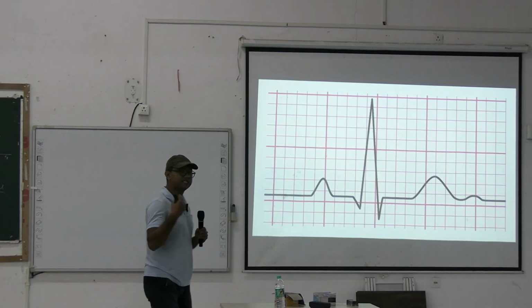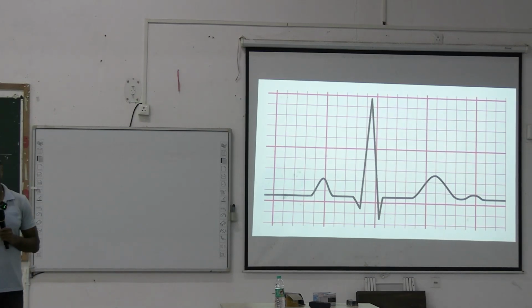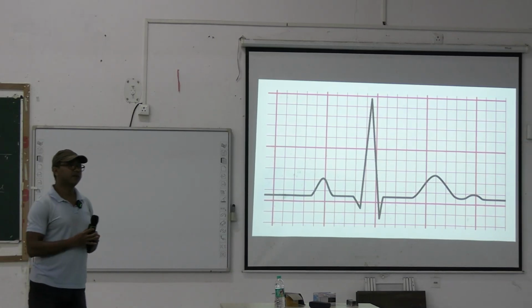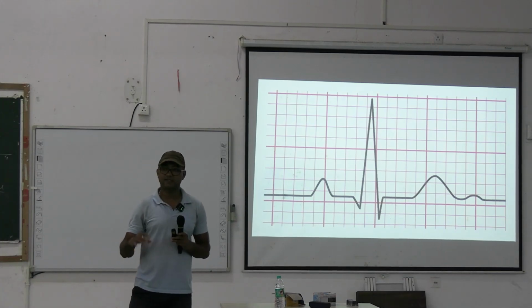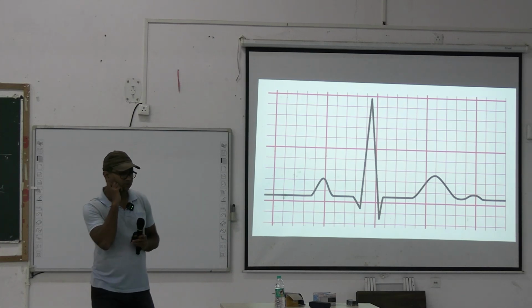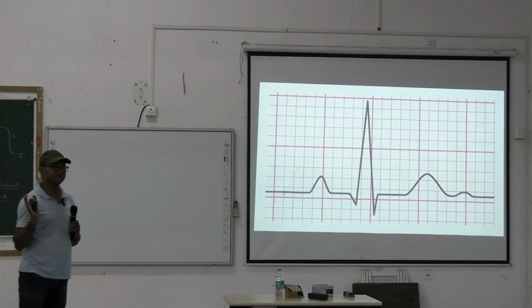Now, tell me what is PR interval? What is PR interval and what does it signify? Yes. Now, that is correct, that is definitely correct. Okay, depolarization wave, it is travelling from atria to ventricle and the time duration it takes is the PR interval. In ECG, do you know what is PR interval?